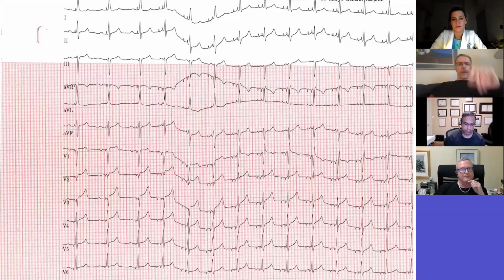And so you end up losing this whole beautiful pacing result, right? Or they increase the thresholds or whatever. So I think that's a testament to the fact that we need to do ECGs during the follow-up.